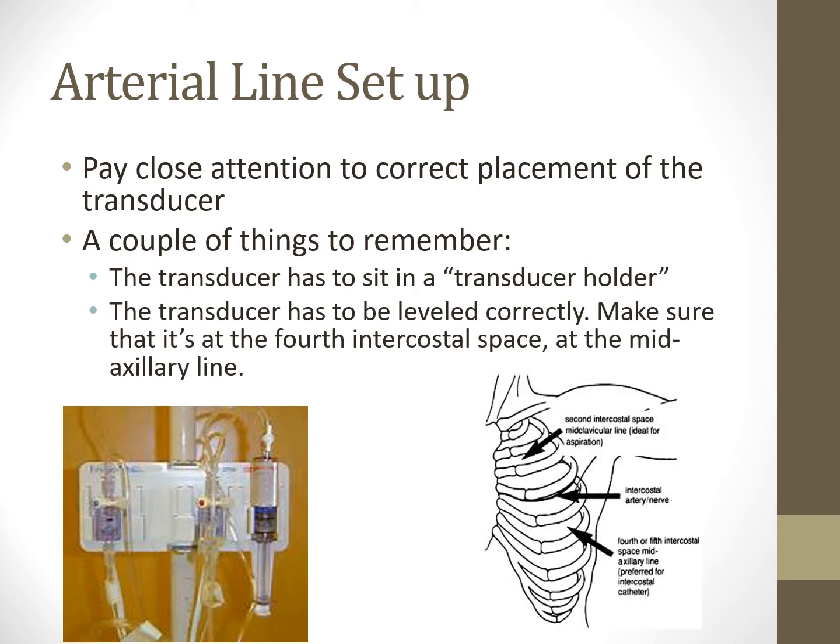Here's the good thing. If someone has an arterial line in place, almost every facility that I'm aware of also looks at non-invasive blood pressures too. So we're going to compare arterial line pressure with non-invasive pressures as well, just to make sure something like this isn't going on. So it's our fail-safe. The fail-safe would be a manual blood pressure cuff, right? Or one that's run by the monitor to verify that the arterial line and the non-invasive are set up appropriately.